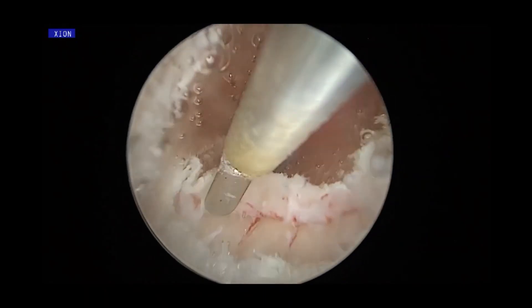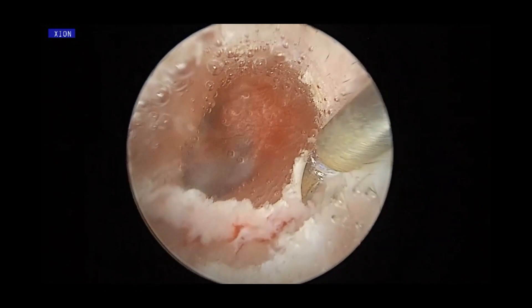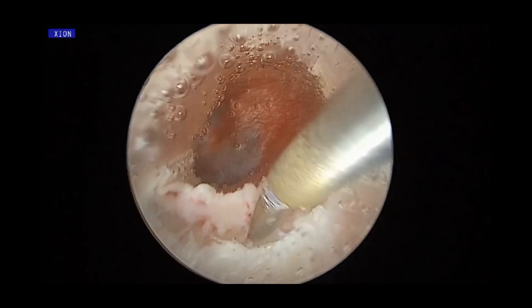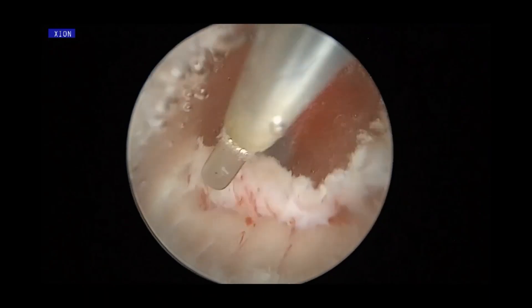At the later stage, when you want to do reconstruction, you can see there is some gap between your canal incision, but that does not affect good healing.